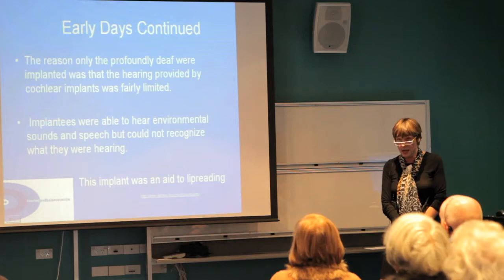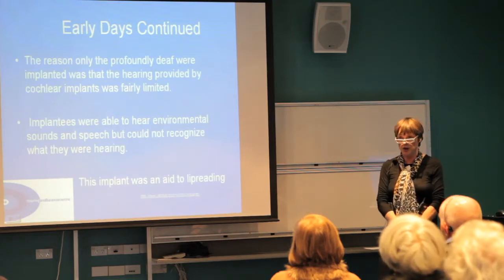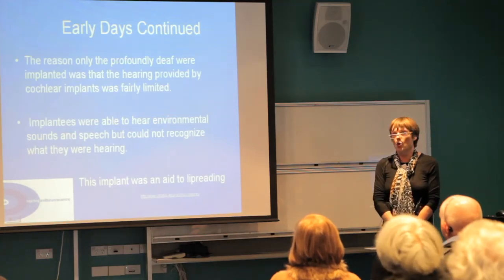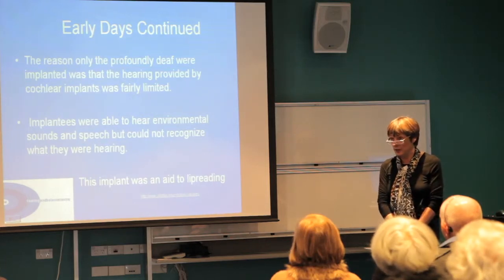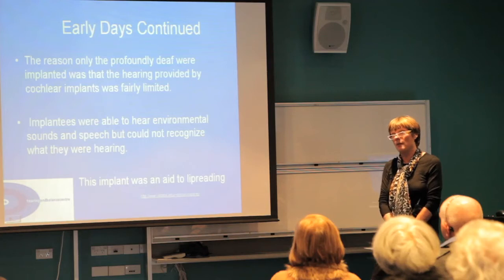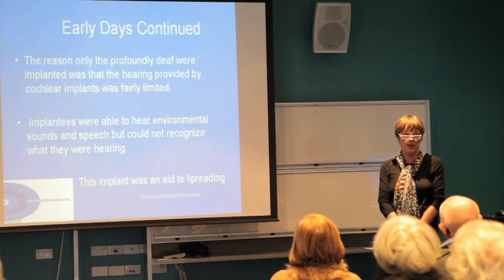Implantees were able to hear with it, but it was very gross hearing, and to tell the difference between sounds was very difficult. They might confuse somebody flushing the toilet with a vacuum cleaner, or someone frying food with another sound. So they might think the microwave beep was someone frying food. So there was a lot of confusion with what they were hearing, but they could hear sound and they could hear speech. But again, they couldn't tell what speech they were hearing very well. And basically, the single channel implant used to work as an aid to lip reading. It helped people lip read because it told them if a word was long or short or what was happening.